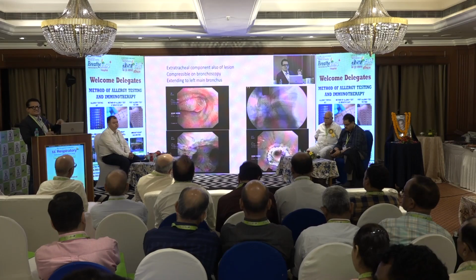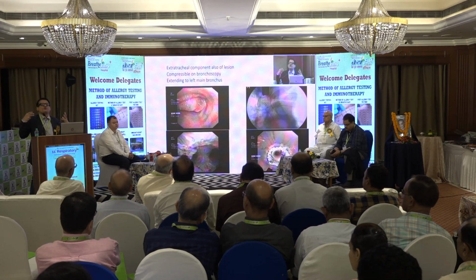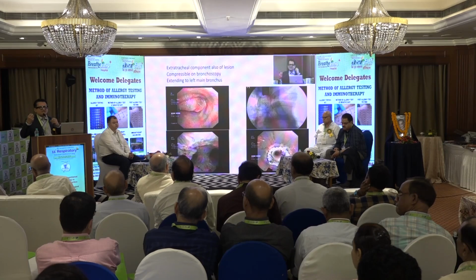65-year-old male, small cell carcinoma, not responding to chemotherapy. You want to give radiation. This is the trick here. He cannot lie down to get radiation therapy. So what we did for this patient is, this is how you create an artificial airway almost. We put in a Y stent and open up the airway. The patient can lie down now, his breathlessness becomes less, and he qualifies for radiation. The point is, all these techniques are available, and we can use them appropriately in selected patients.